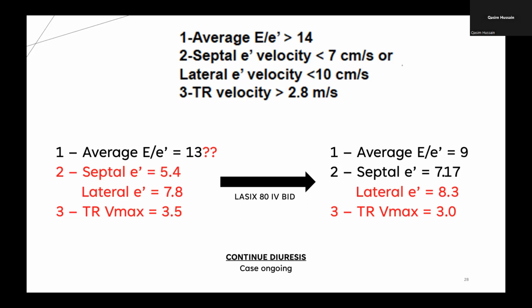And I should mention the reassessments are quite short. They're a lot faster. I didn't go through all the views. I just looked for the information I was looking for. So basically just getting the hemodynamics of it. And you could certainly spend more time looking at the left atrium to maybe get smaller, your right ventricle to maybe get a little bit smaller.